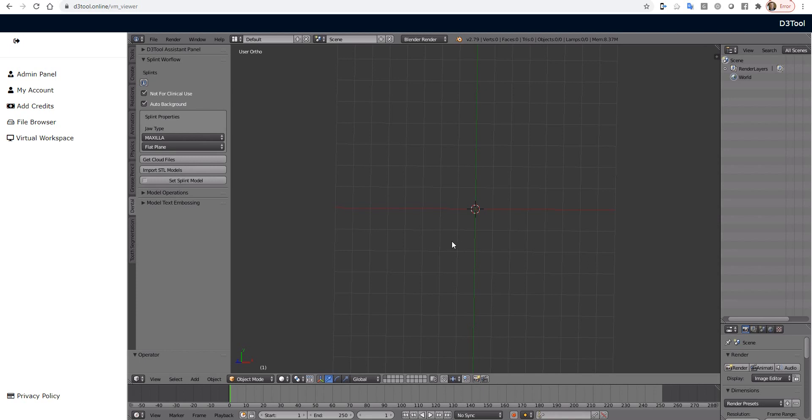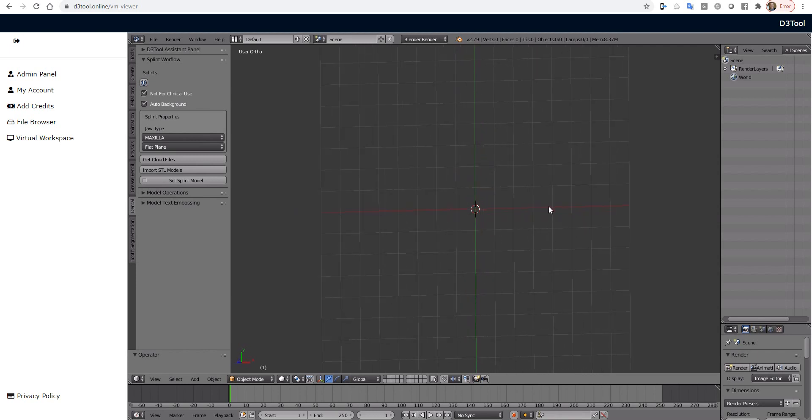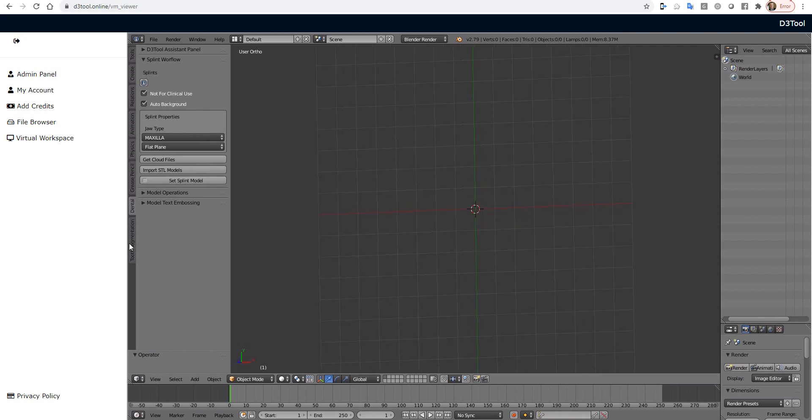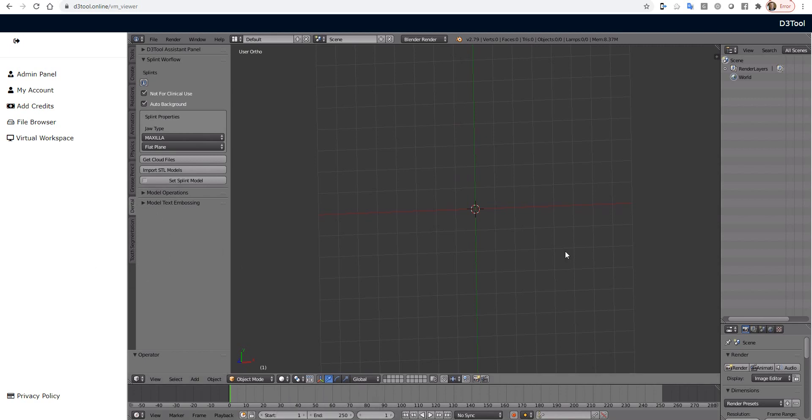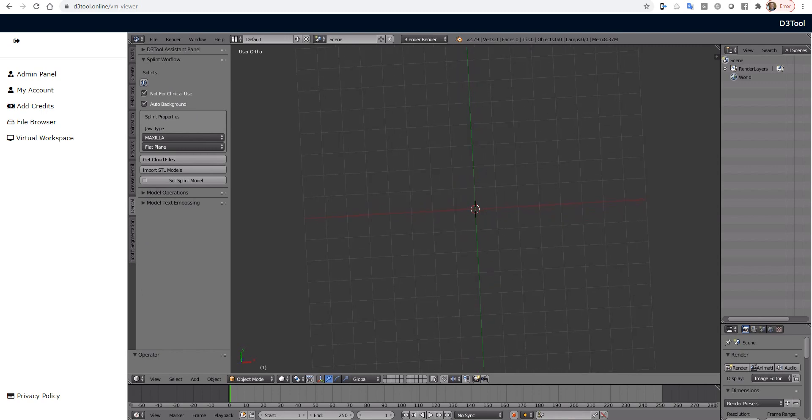All right, I want to show a new workflow that we're going to add into D3Tool online. So I'm here loaded up in our virtual machine. And down here, there's another new tab called Tooth Segmentation. This is just a reboot of an old project that we never had time to make into an actual product. But now we're going to start building those out in our online format.